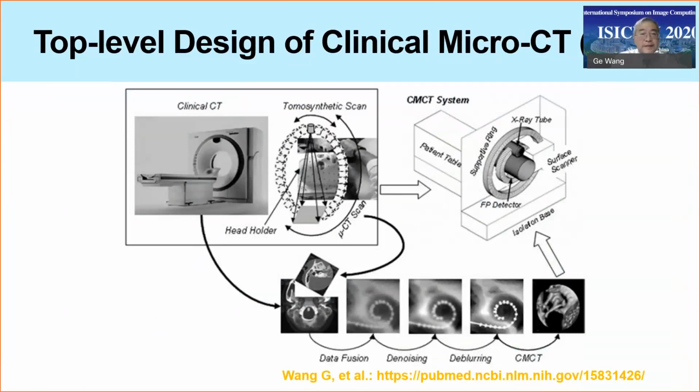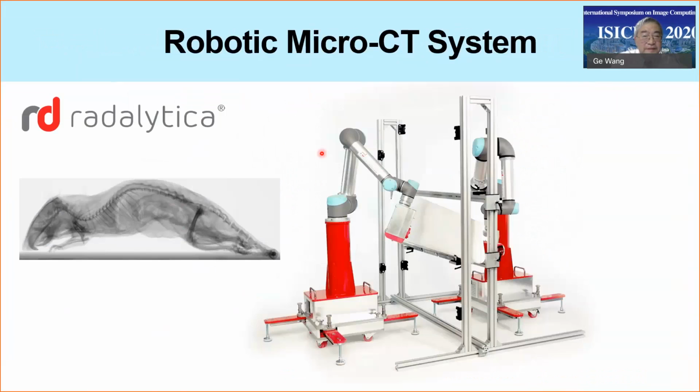The last thing I mention is the clinical micro CT concept. We had a paper published decades ago, trying to get very high clinical resolution in vivo, particularly for cochlear implantation. Recently, we are collaborating with a European company that has a robotic arm.